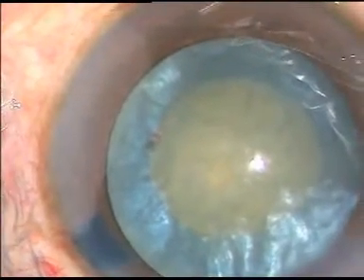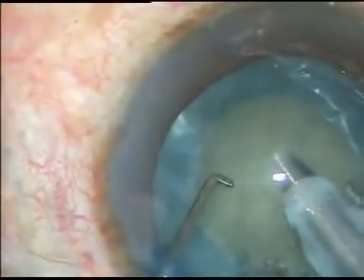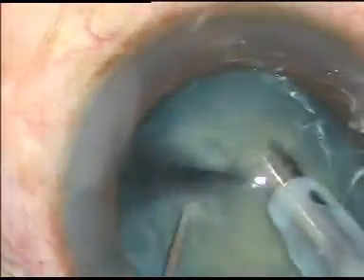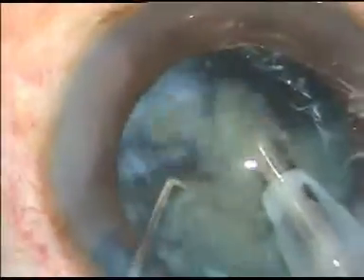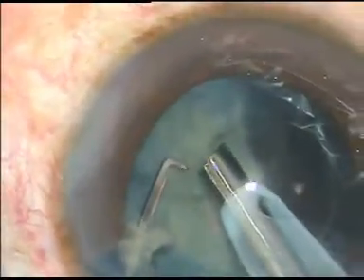I use Appasamis Galaxy CV on machine at present. The tip of the phaco handpiece is embedded and it is chopped. Setting at this time is phaco power 50, vacuum 190 and flow rate 40. I chop the nucleus into several fragments and each fragment is emulsified and aspirated. Emulsified into very fine small pieces and it is sucked out of the eye.